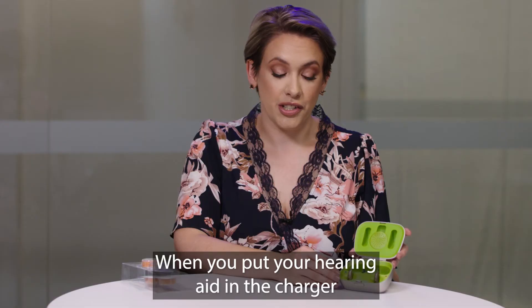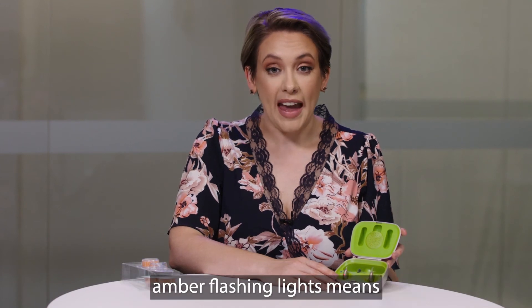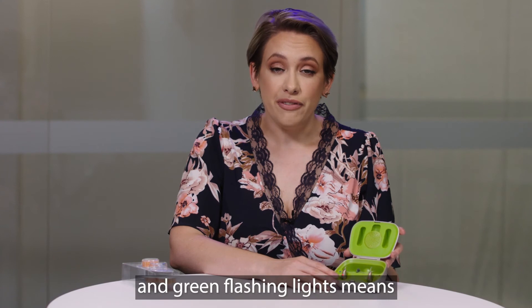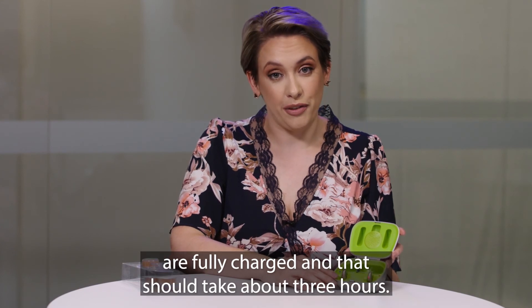When you put your hearing aid in the charger you'll see flashing lights. Red flashing lights means your hearing aid has minimal power. Amber flashing lights means it has a moderate level of power, and green flashing lights means it's almost fully charged. Solid green lights means your hearing aids are fully charged, and that should take about three hours.